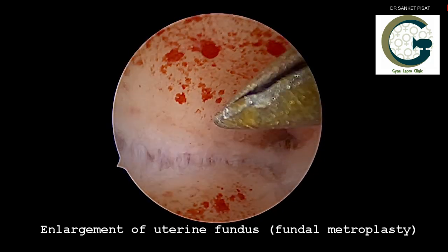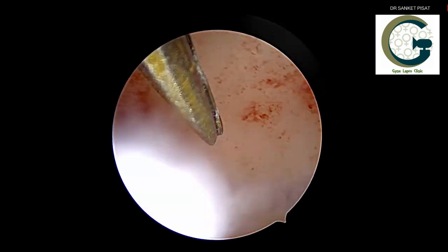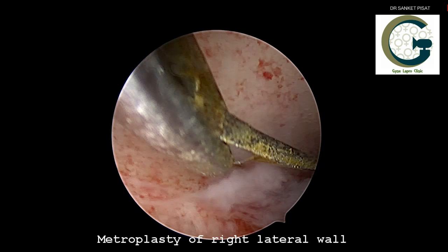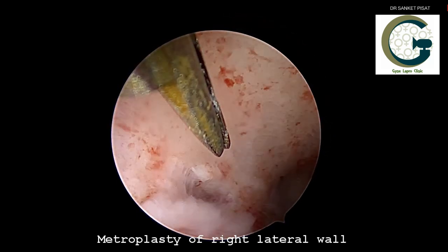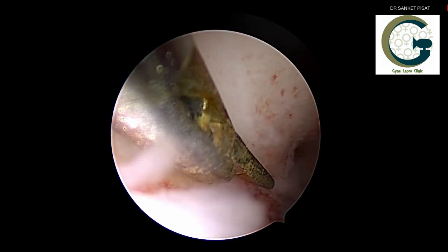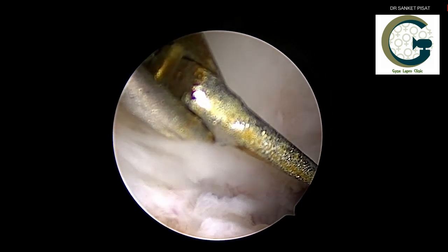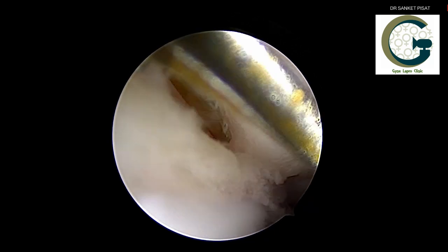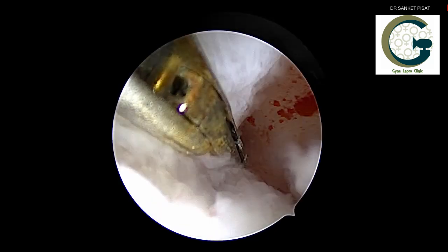We now move on to the third side: the right lateral wall. After two walls have been corrected, we start with the correction of the right lateral uterine wall. As the scissor cuts the uterine tissue, one is able to make out how hard the tissue is — this hard, fibrous tissue without blood vessels is the reason the patient is not able to get pregnant.